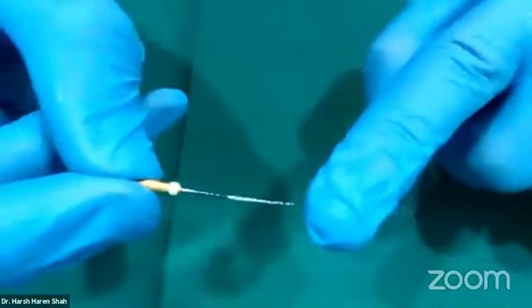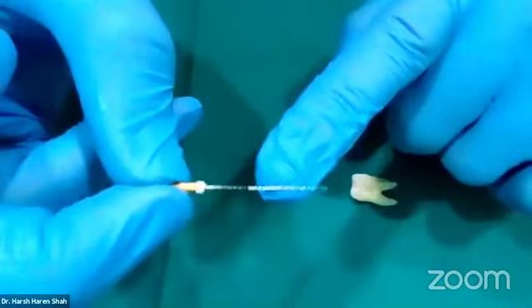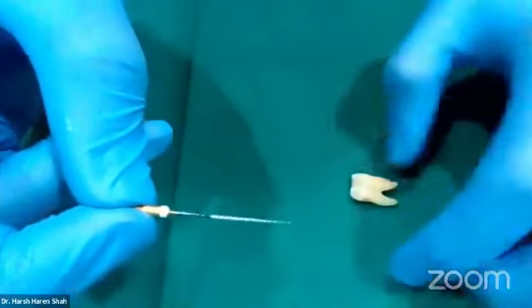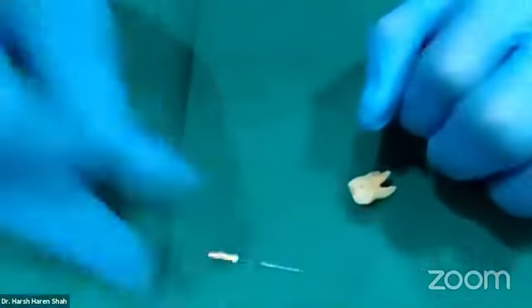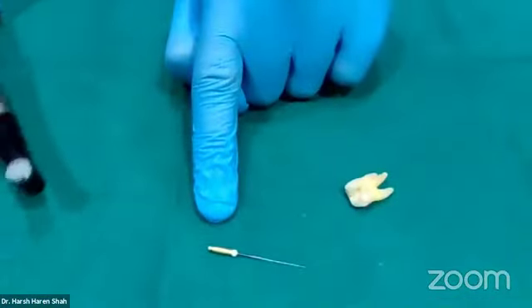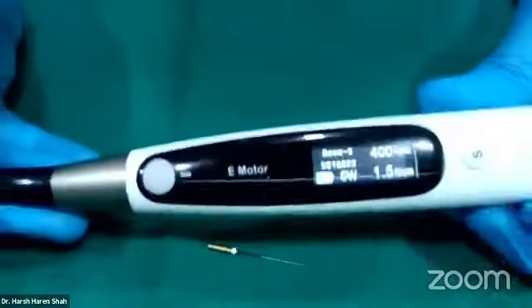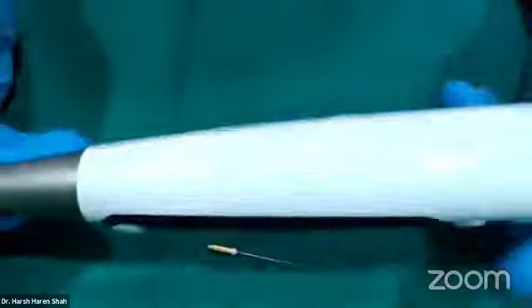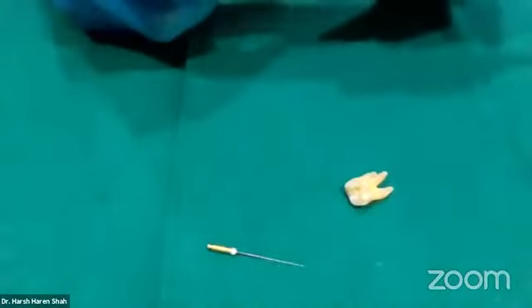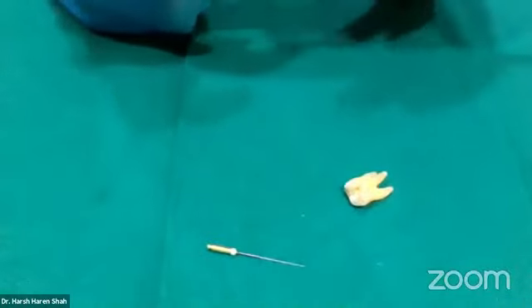So this was the file that I was saying does not engage all three flutes on the walls of the dentine. Only one of the edges is going to cut the dentine. So let's see how we use this file now. For using any rotary glide path files, you will obviously require an endodontic motor. So the endomotor that I'm using here is a Motopex. I will have to set the speed and torque for this particular file. Your endomotor may come pre-fed with these values as well.